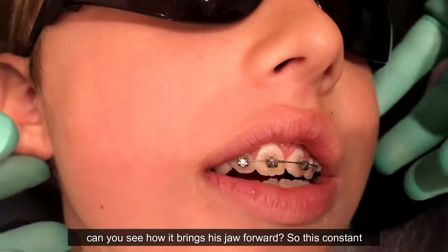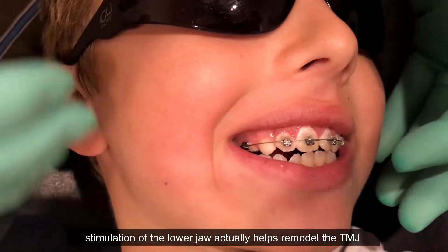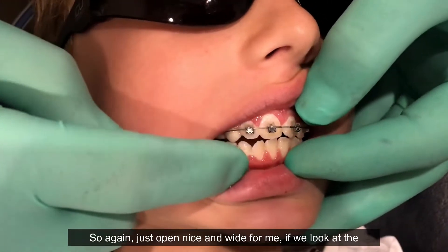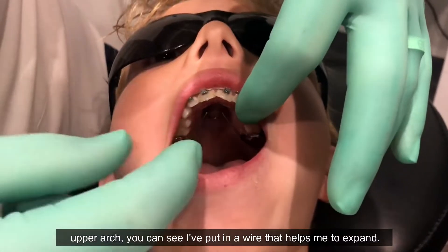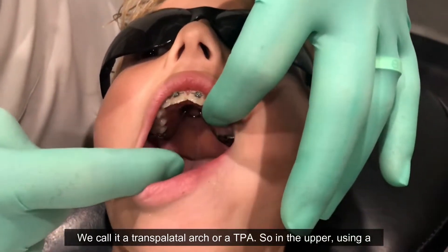This constant stimulation of the lower jaw actually helps remodel the TMJ, so you get stable correction of the Class 2 bite relationship. If you look at the upper arch, you can see I've put in a wire that helps me to expand — we call it a transpalatal arch, or TPA.